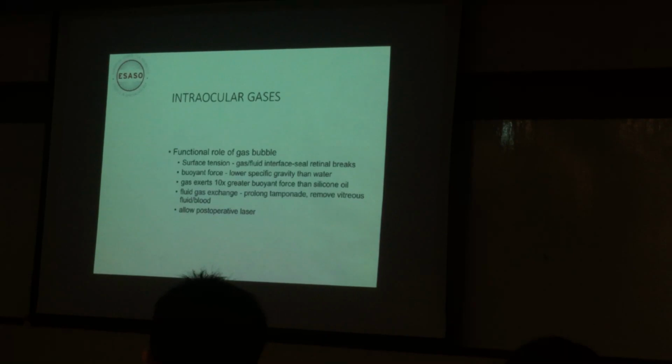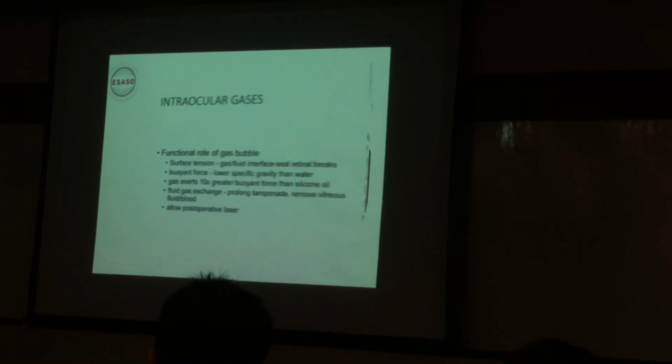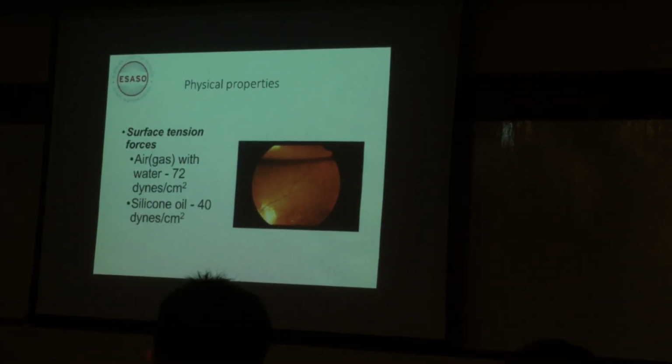And in a well-filled eye, you can easily perform postoperative laser using the wide-angle lenses and learning the technique. So you can even perform laser through the gas.